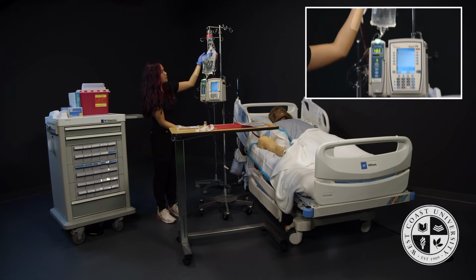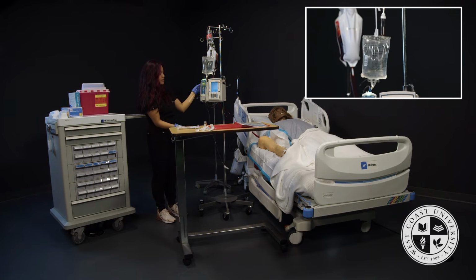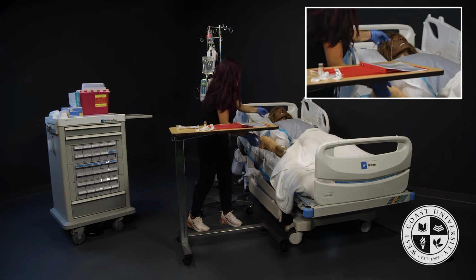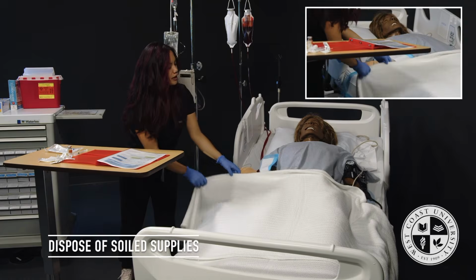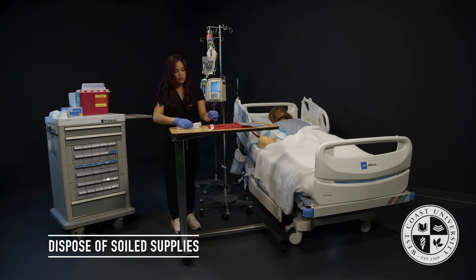and wait for the first few drops. The first few drops have started. This will be infusing in 15 minutes. All right, Mrs. Cruz, your IV medication is now infusing. Do you have any other questions for me? No, you don't. So I'm going to go ahead and gather my supplies to dispose at the proper receptacle.